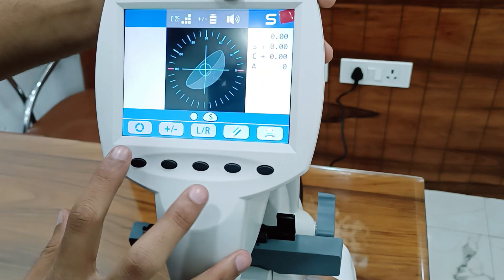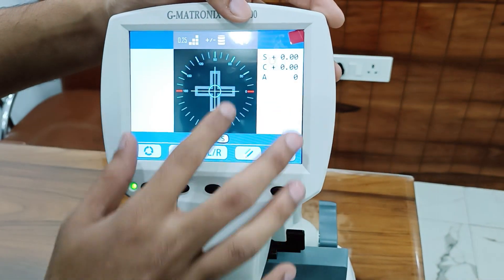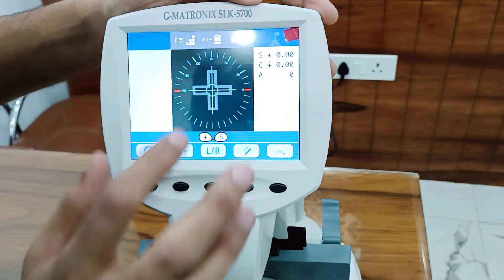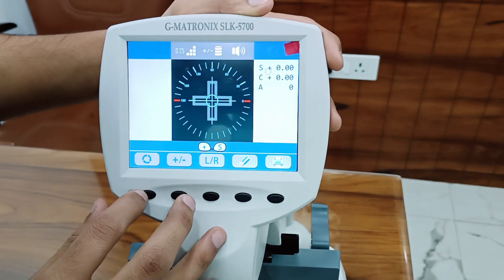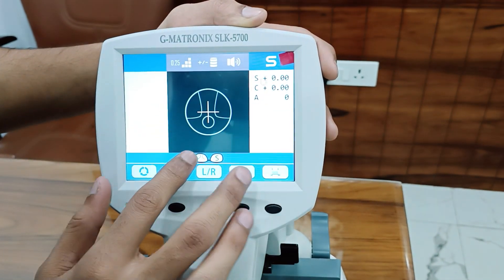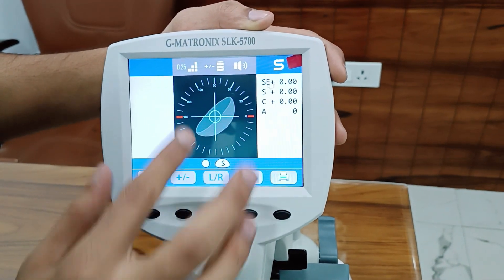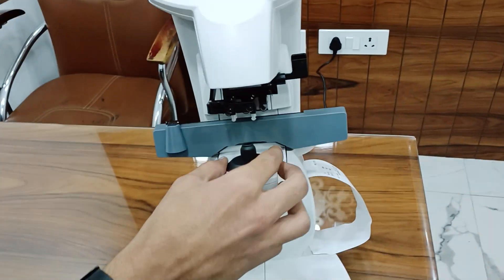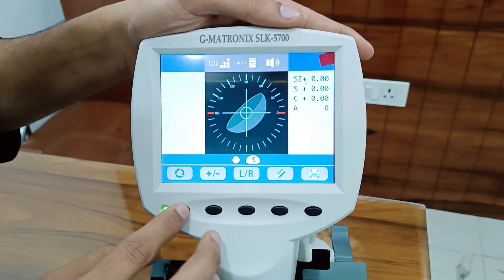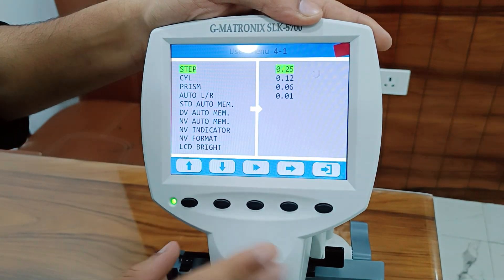This lensometer has three modes: auto mode, single vision mode where you can take reading for single vision or progressive or compound lens, and bifocal/trifocal/progressive mode. There is also a contact lens mode — you will need to change the lens bracket for that. If you press the button for two seconds, you can go into settings.